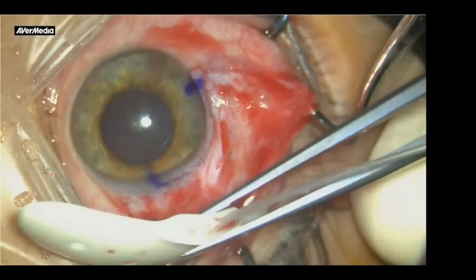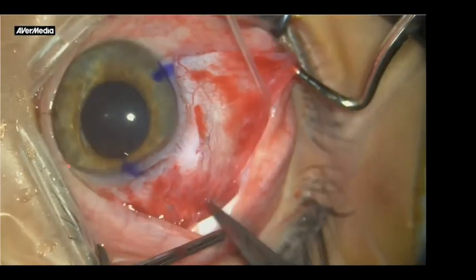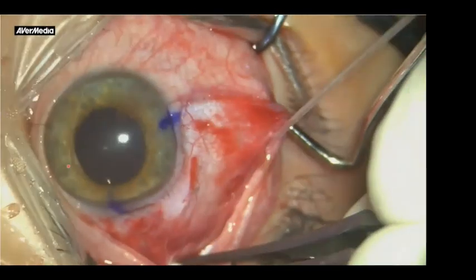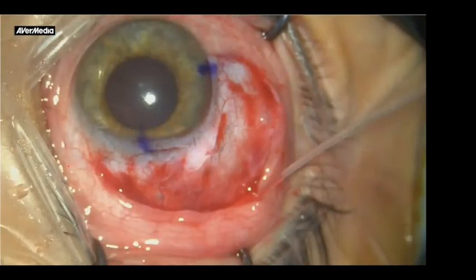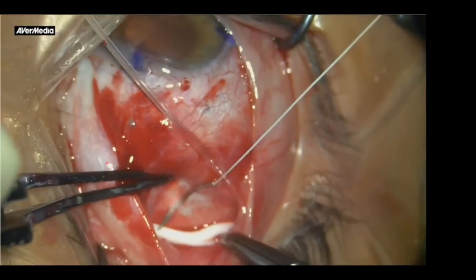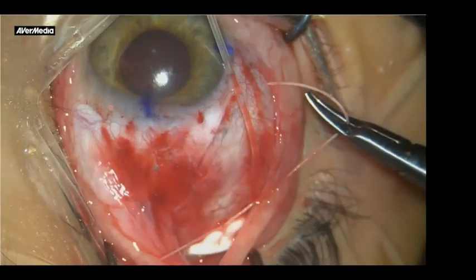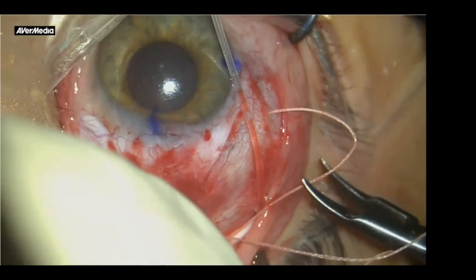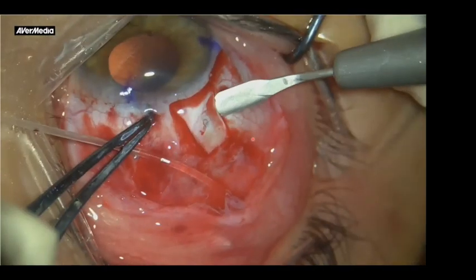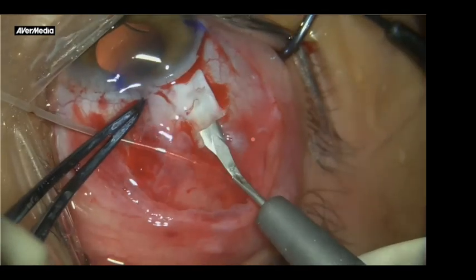This is the Baerveldt, our Aurolab. I'm not using it actually because it's very bulky. It needs a lot of work. And the wings will go underneath the muscle. And this is one of the non-valved implants. That means after you fix the plate, you need to ligate the tube, with absorbable sutures. I put 2 absorbable sutures until the peri-plate capsule is formed, and then it will spontaneously work.